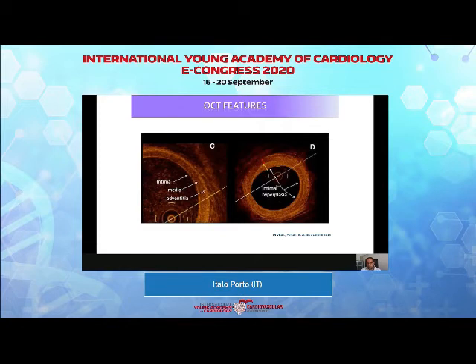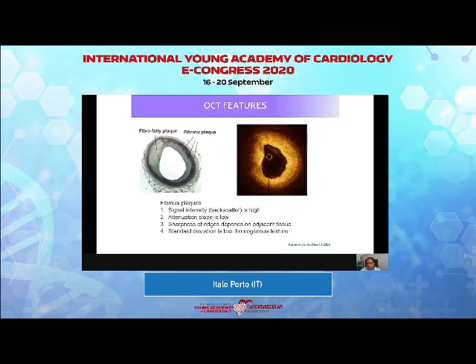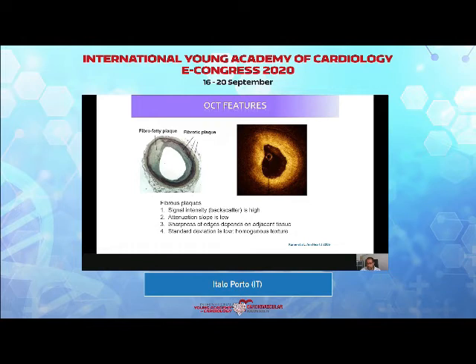What about OCT? With OCT you have higher resolution — you can more or less identify the intima, easily identify the media, and quite often see the external elastic membrane and adventitial tissue. You can clearly see the early levels of atherosclerosis such as intimal hyperplasia. You can identify features pointing to specific plaque types: fibrous plaques are associated with high backscatter, low attenuation slope, and homogeneous texture.